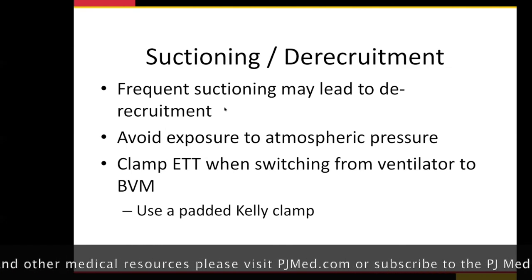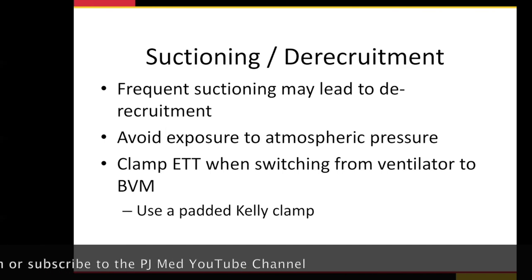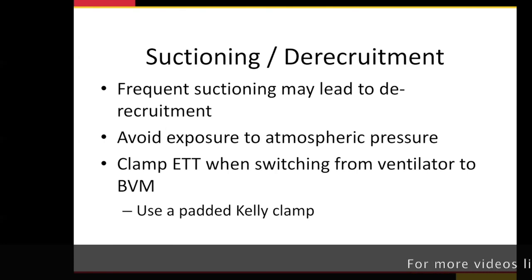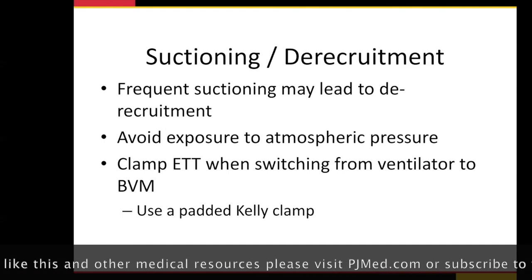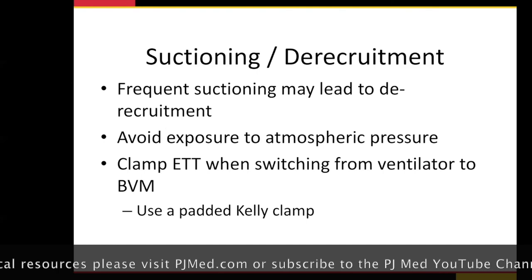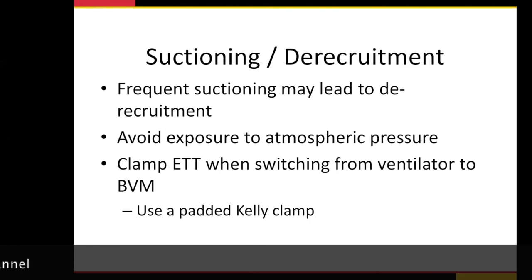If you suction them, the problem is you're going to de-recruit them. In other words, all the air you pumped in them is going to get sucked out, and their lungs are going to snap shut, and they're going to get what we call atelectasis. That can be hard to open up in a diseased lung because the lung gets really sticky. If it closes in on itself, you have to give it a lot of pressure to open it back up again. But if they have a mucus plug or something that prevents the air from going in, you have to get rid of it. So suctioning is an option. Sometimes it's not an option. You have to do it.